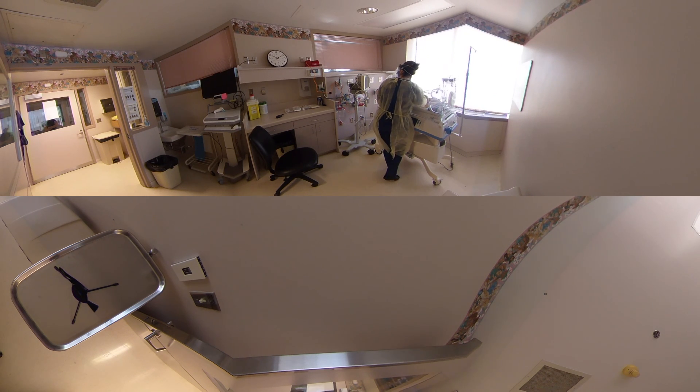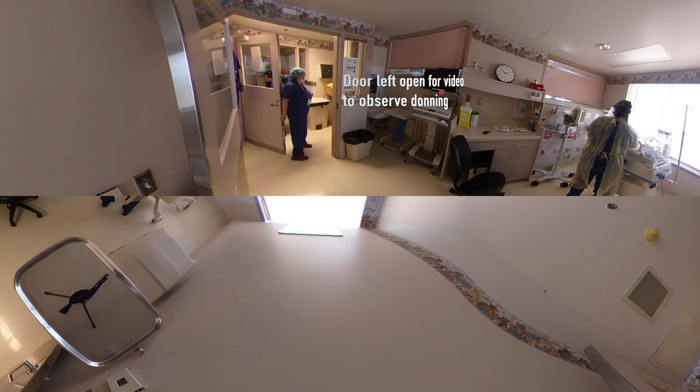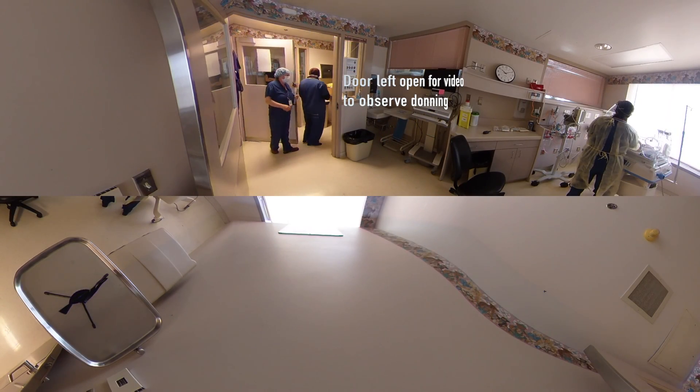I'm bagging and the heart rate is coming up. Nadia, I'm going to talk you through donning because you need to go in the airborne room.